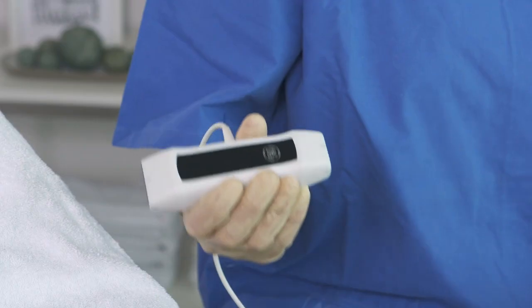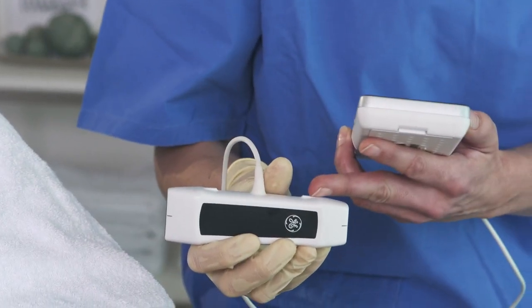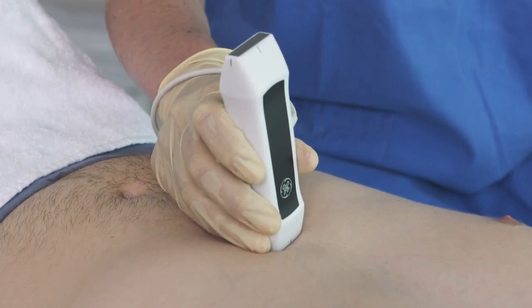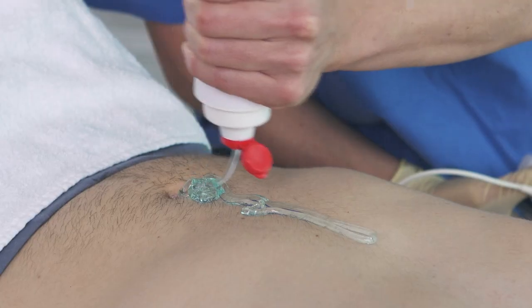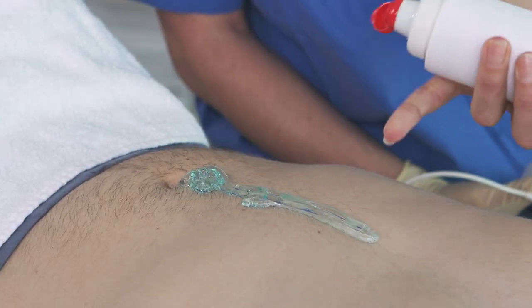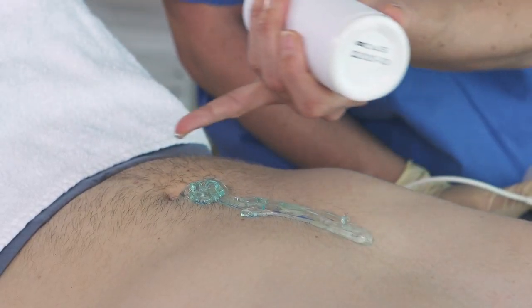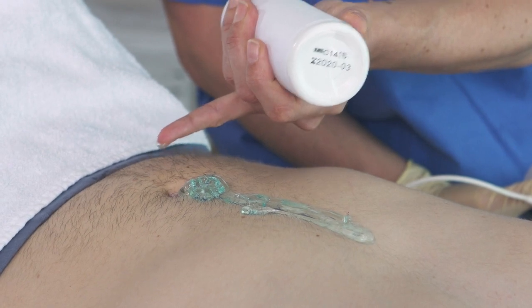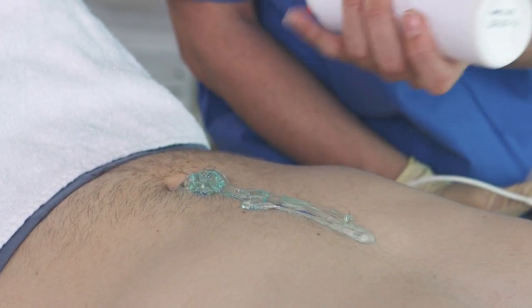We are going to use a phased-array probe and start in the transverse view. The marker of this probe should point to the right-hand side of the patient. I start by putting enough gel from the xyphoid area down to the navel area to scan the complete abdominal aorta.